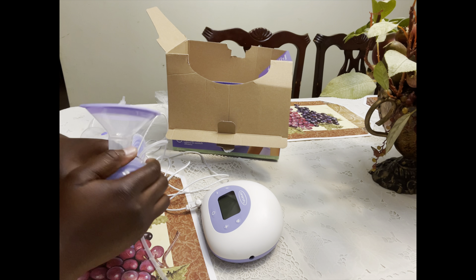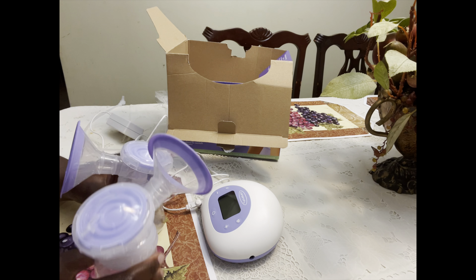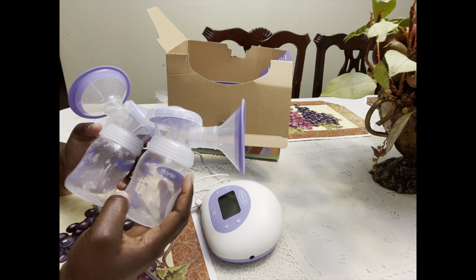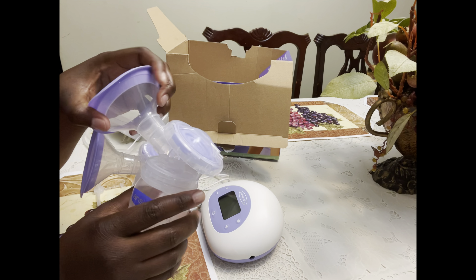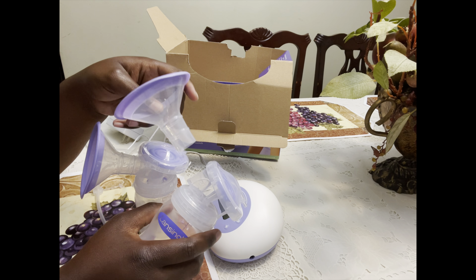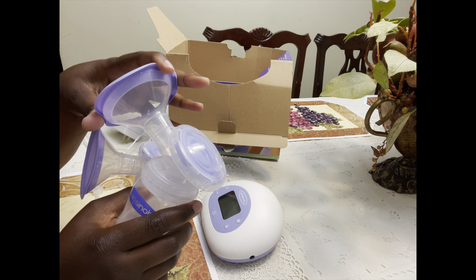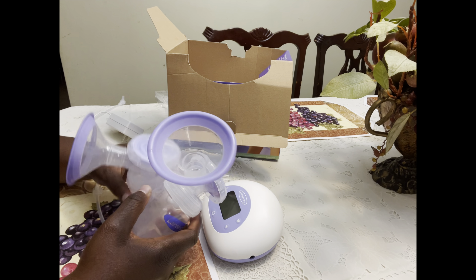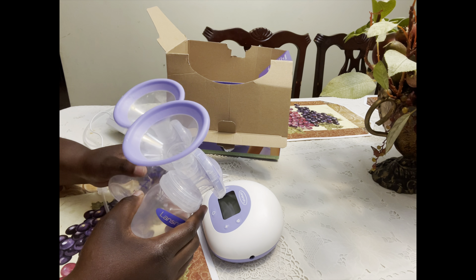It already came attached together. When I first got this, it did not come like this, so this is really a bonus for you guys if you've already bought this. It came already attached because I remember having to put all the tubes and the top together detached. But as you can see now, it comes already together — you just put the top on and turn it into the clip.